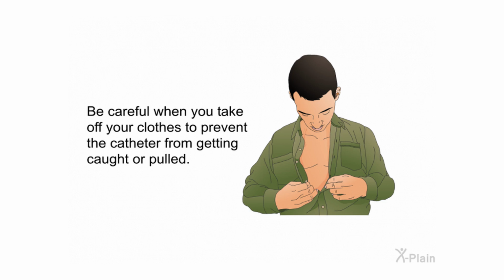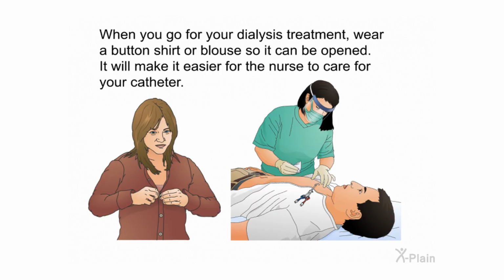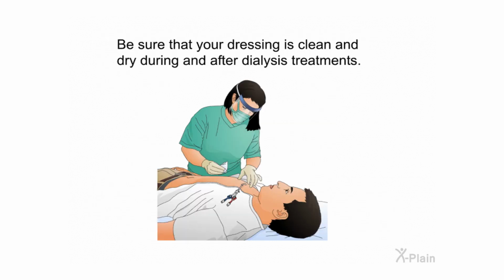Be careful when you take off your clothes to prevent the catheter from getting caught or pulled. When you go for your dialysis treatment, wear a buttoned shirt or blouse so it can be opened. It will make it easier for the nurse to care for your catheter. Be sure that your dressing is clean and dry during and after dialysis treatments.